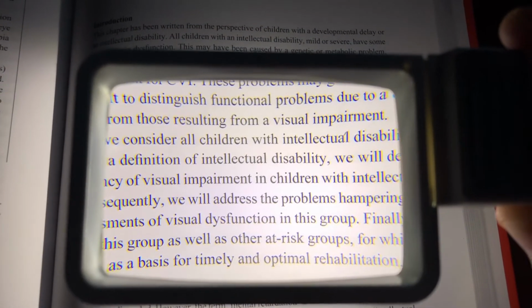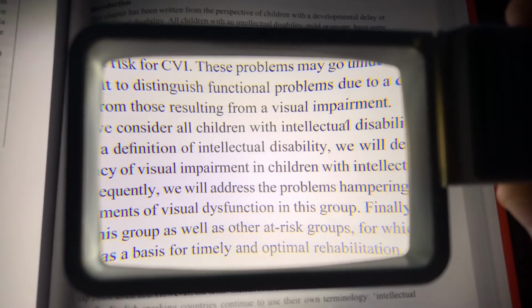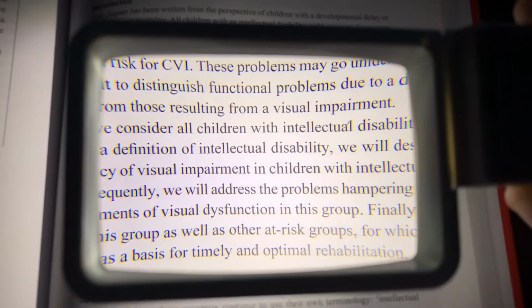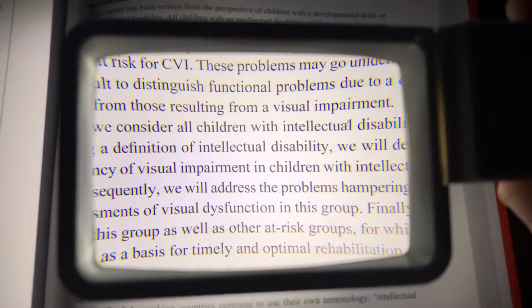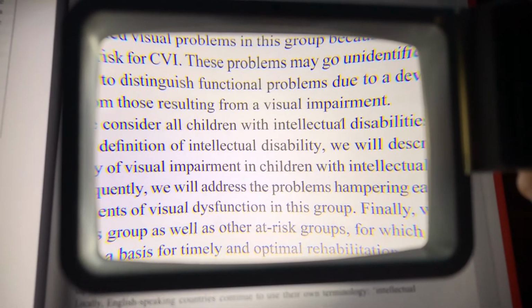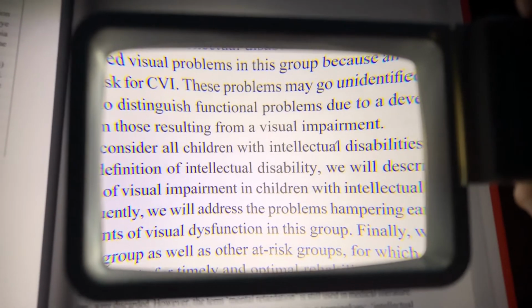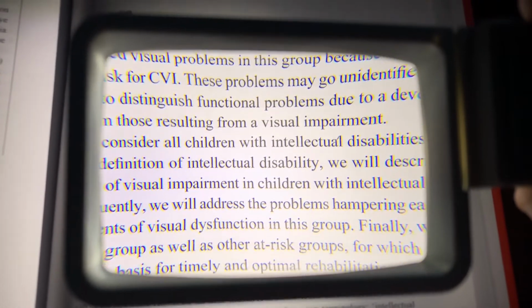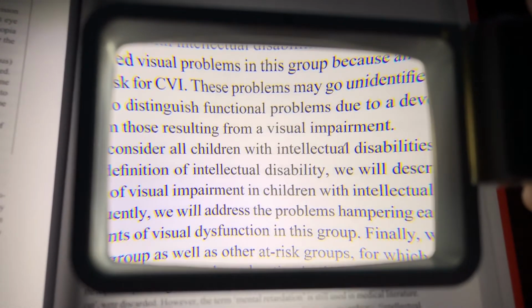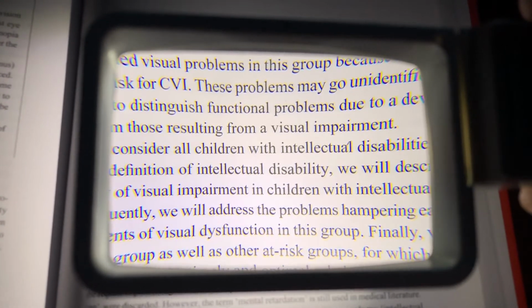Now we have the 3.5x handheld magnifier from Magno, and likewise, it does a good job of flooding the area with the light. This is a straight handle versus an angled handle like on the Optelec, so that's not an apples to apples comparison. But you can see that the viewing area of this 3.5x is larger than the 3.5x comparison of the Optelec.